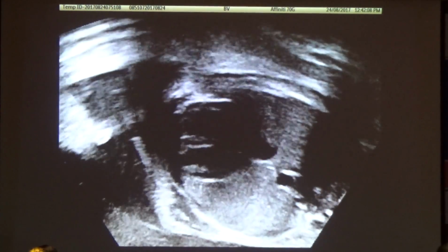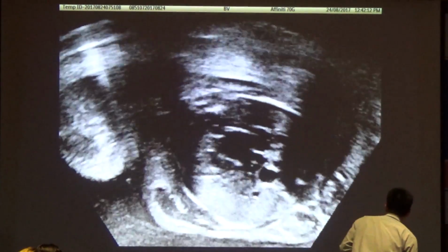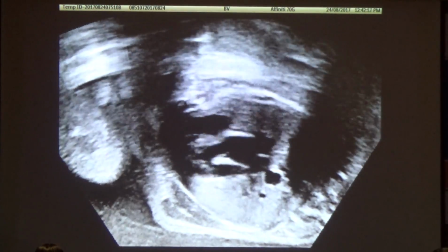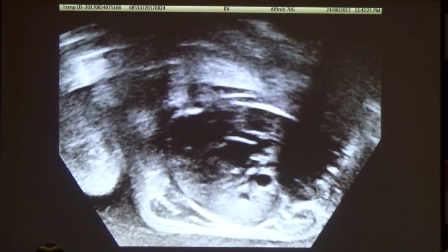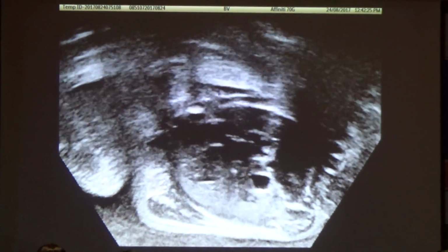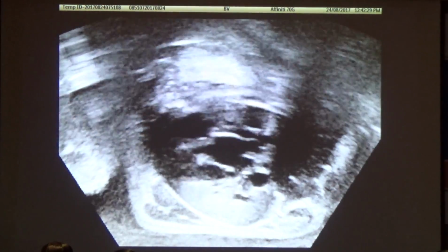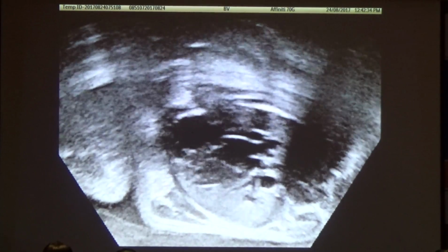Now, sorry. What? Just the image quality on the screen is not so good. Well, but what I've got here is I've got a great picture. I just want to make some adjustments here. There's the big pulmonary artery at the back. I want to see the duct, see? Okay, let's put the color on there, shall we?